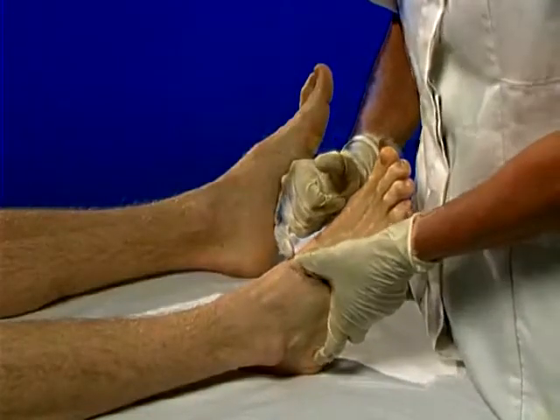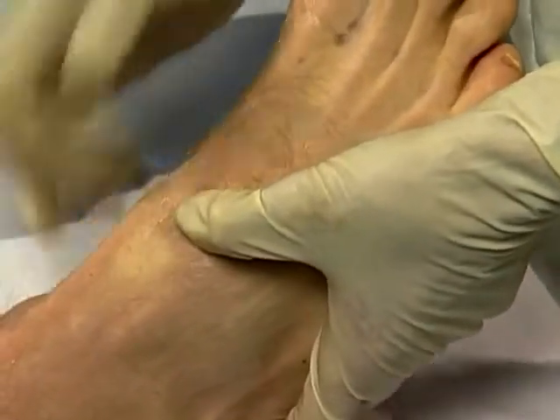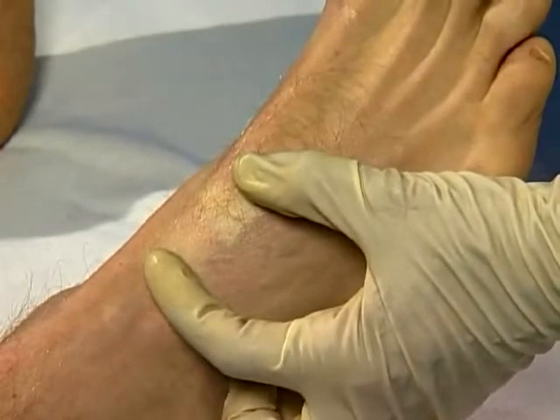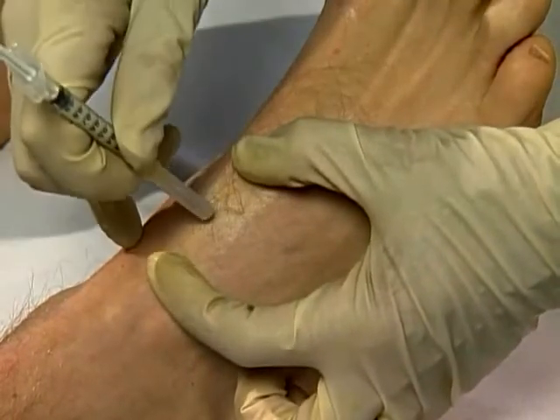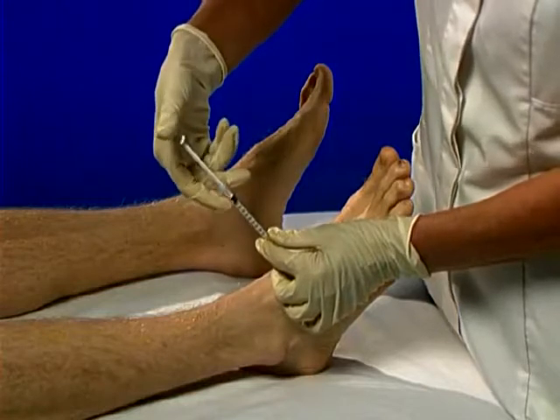Identify the joint line by palpation and by gliding the two bones. Mark the entry point at this joint line, clean and firmly stretch the skin, and rapidly insert needle perpendicularly into joint space. Aspirate and inject as a bolus.